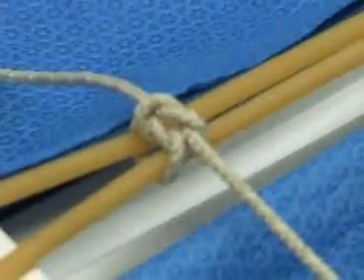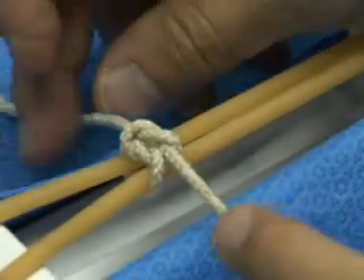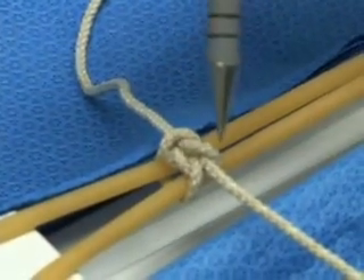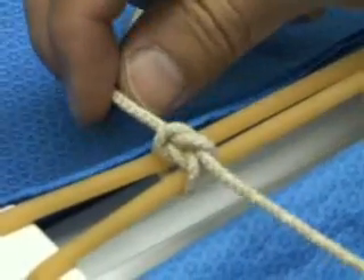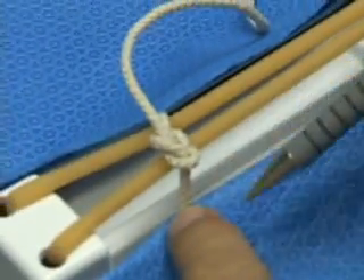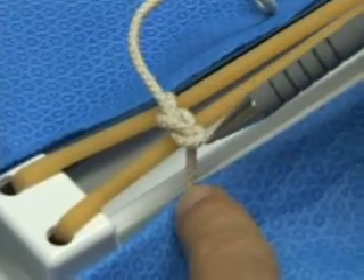In this square knot, you'll see that we have a loop across the top and both strands come under that loop. If you flip this knot over, you'll find exactly the mirror image, with a loop down at the bottom and both of these strands coming out.